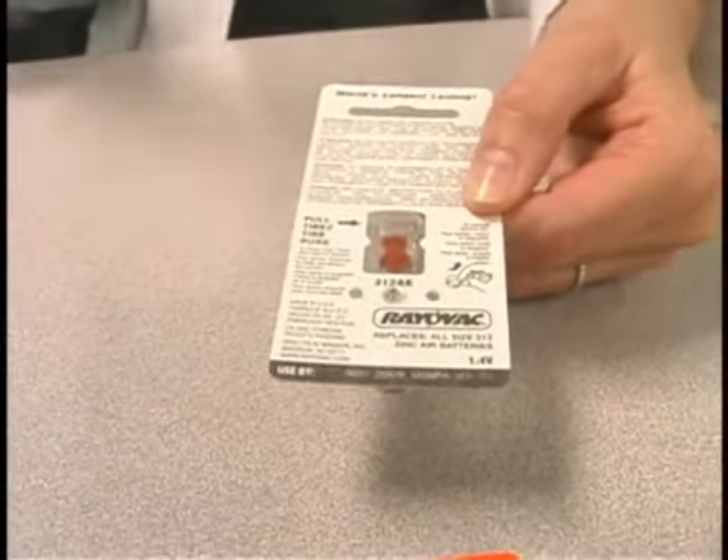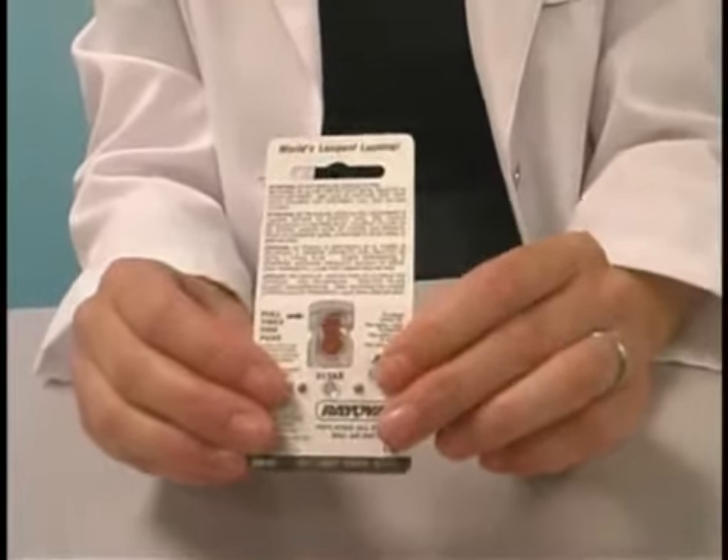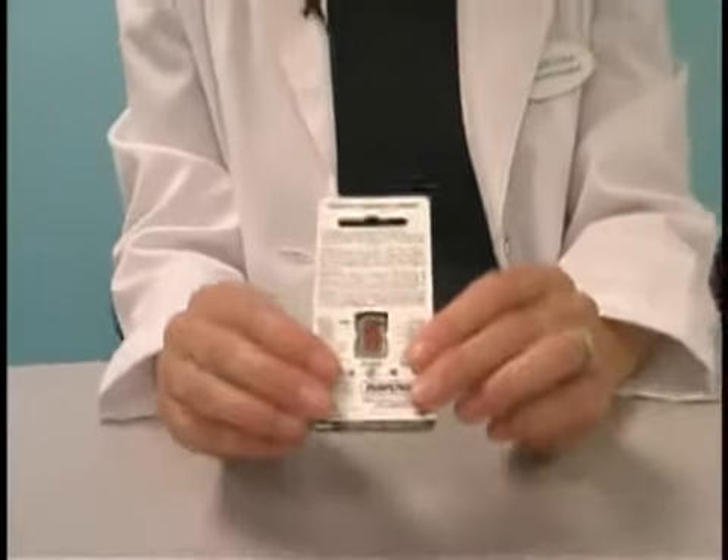So now there's air getting into the battery. They're packaged this way to preserve the life of the battery. The surface of the battery is sealed with the sticker until you're ready to use it. As soon as you're ready to use it, you remove the sticker. That activates the battery, and now you're ready to use it.